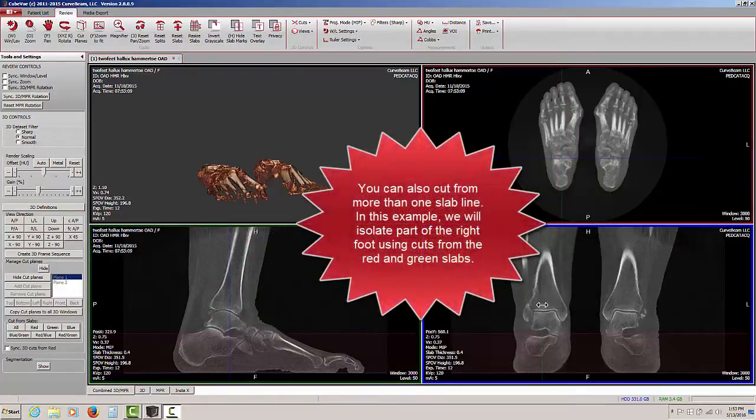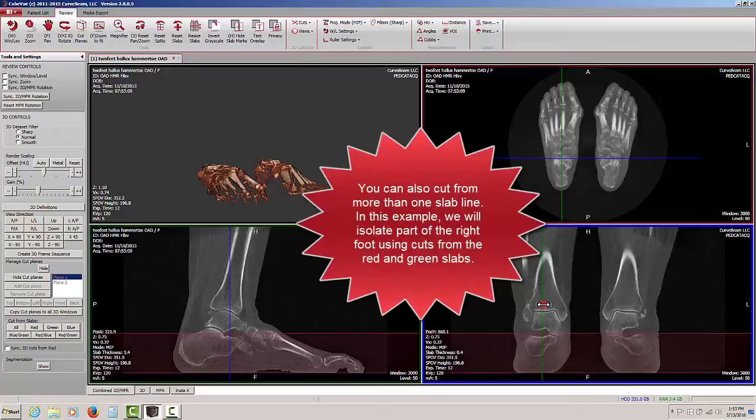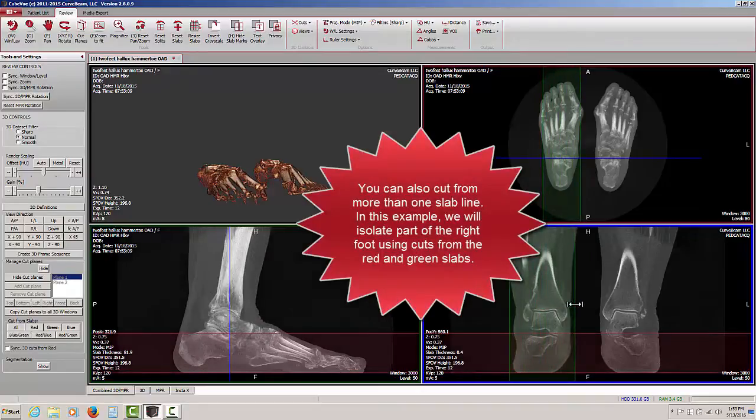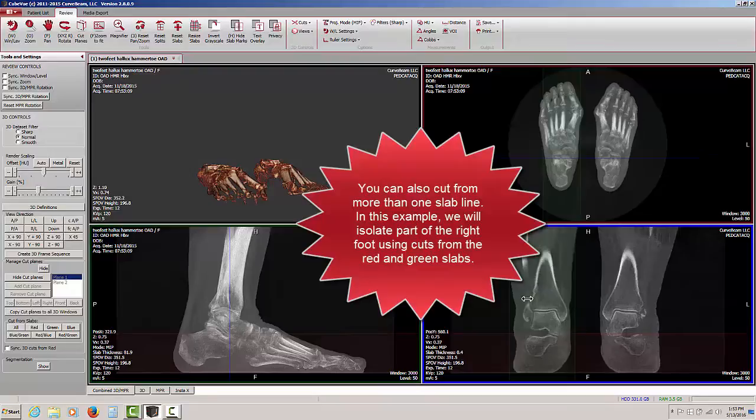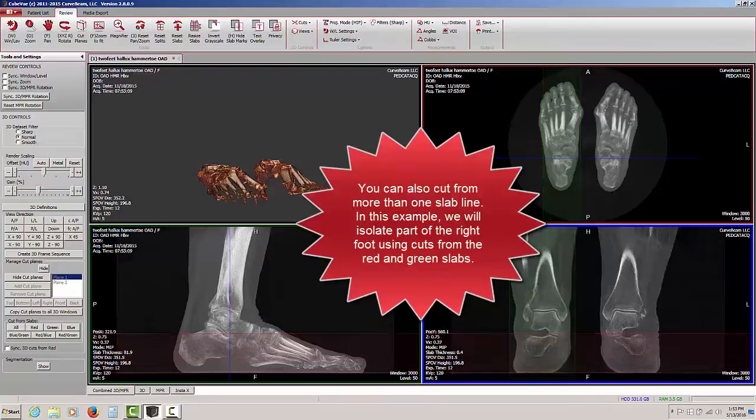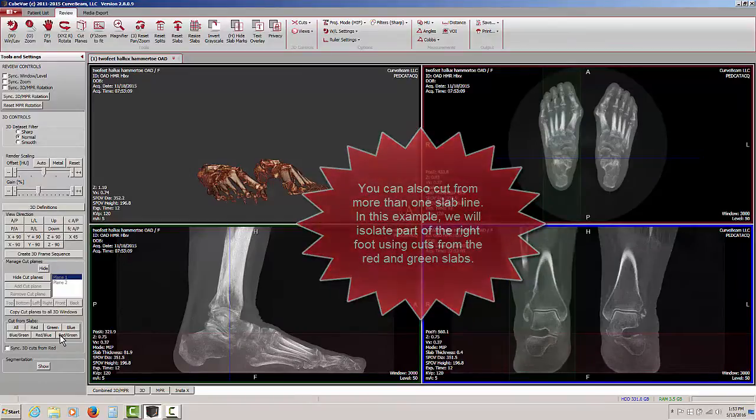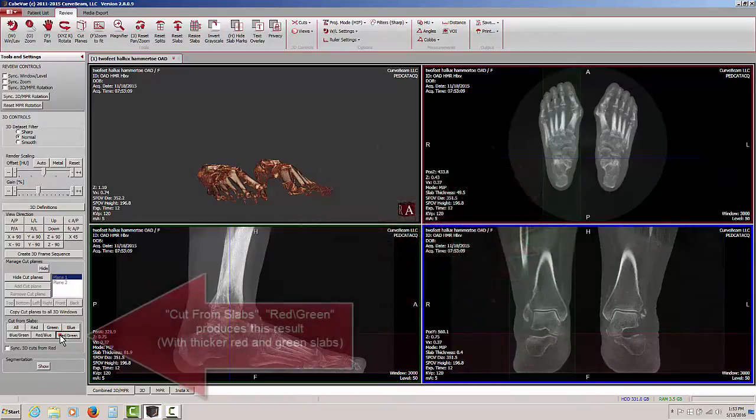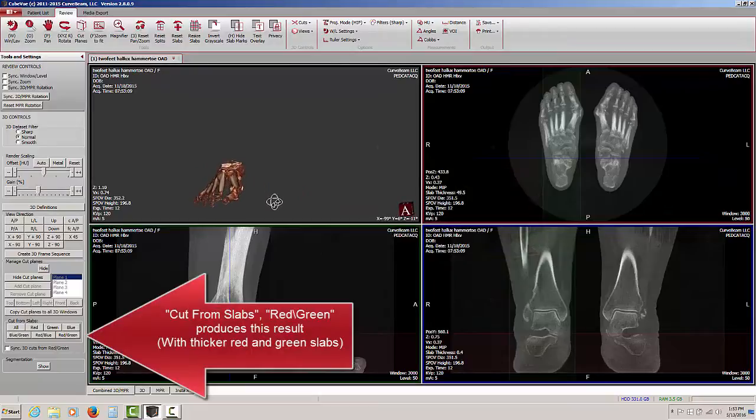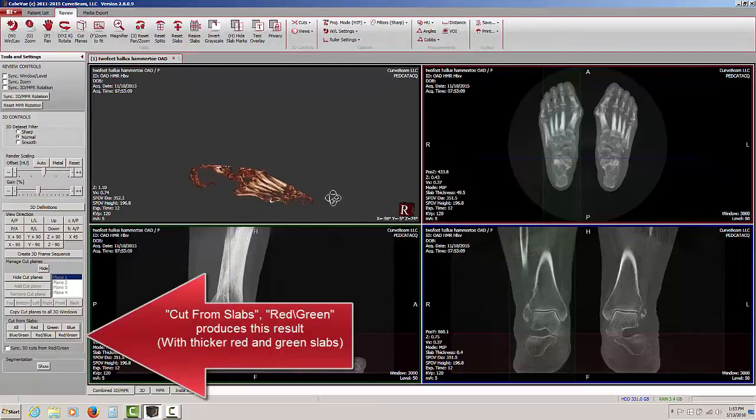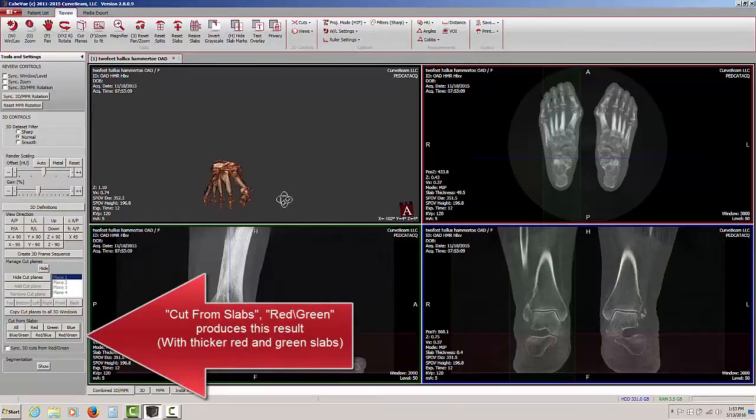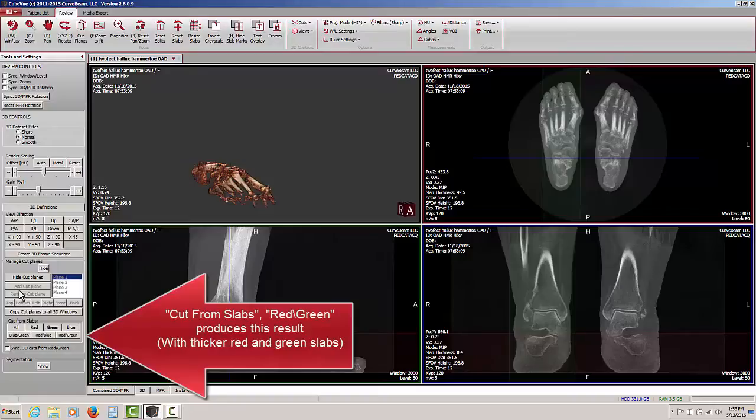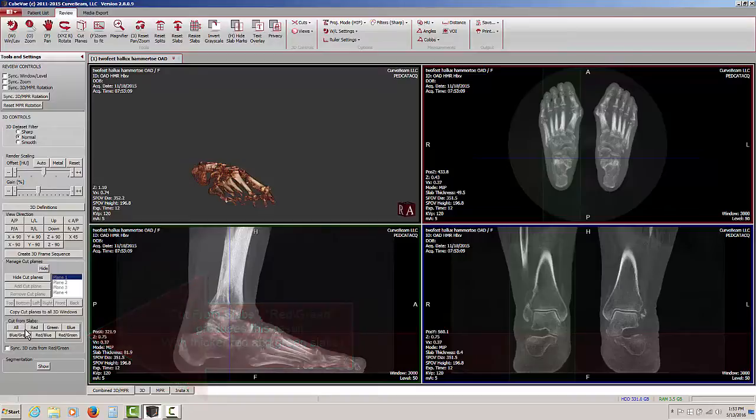We can also further isolate the anatomy by making a second cut from slabs as well. In this case, I have just made the green slab thicker so that we are going to be looking at the patient's right foot. And then I am going to select show me red and green together. So now we have a significantly smaller volume in the 3D rendering window than we did before, isolating just one foot and then isolating part of just one foot using cuts from slabs.